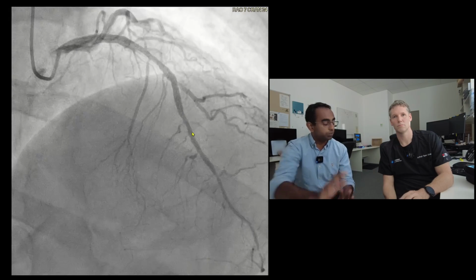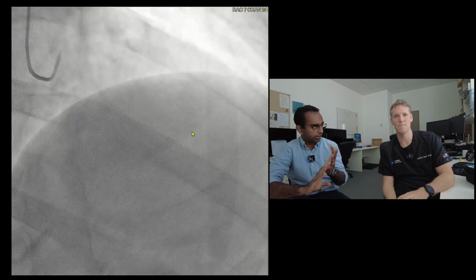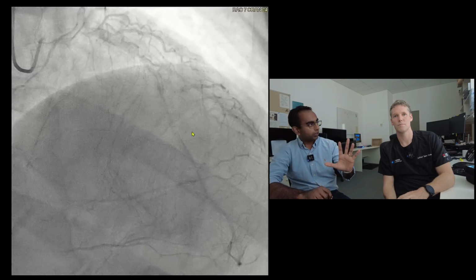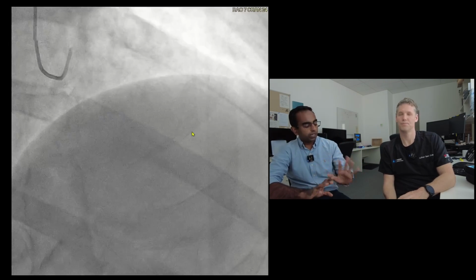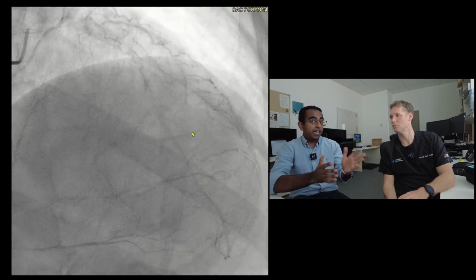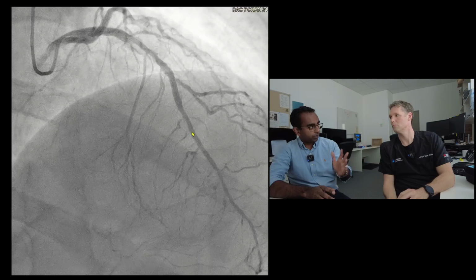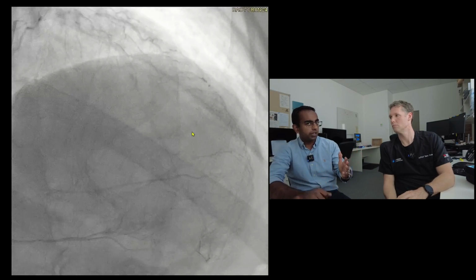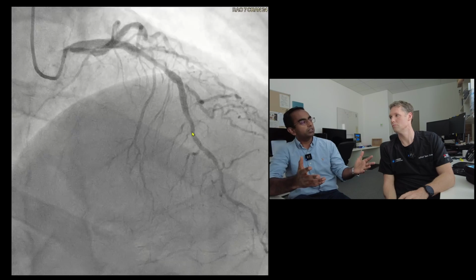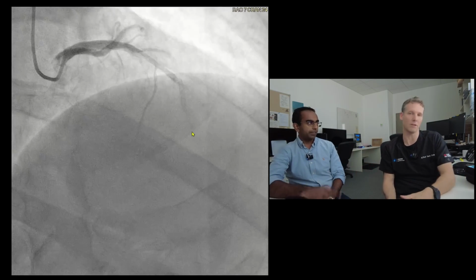That's not your critical lesion, because I know from the ECG the culprit lesion is the inferior, or the right coronary artery, based on the inferior ECG changes. I also know that based on the echo. So the echo and ECG are quite helpful before the angiogram to say, okay, what is the culprit? Because sometimes you may have multiple lesions. You may have an LAD which is tight but not critical, or may require intervention, and you've got the right coronary which is also tight and may require intervention. Then you don't know which one is the culprit artery. But you'd go for the culprit based on the echo and the ECG, and that's exactly right.